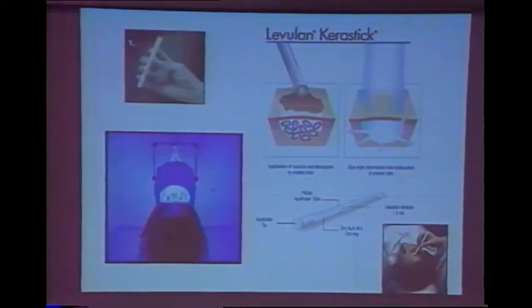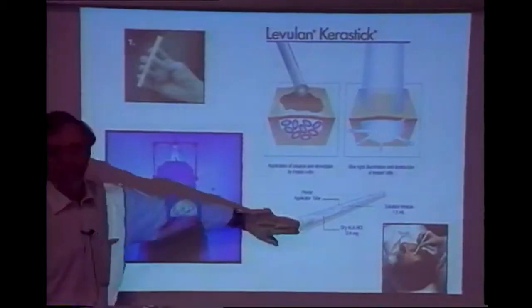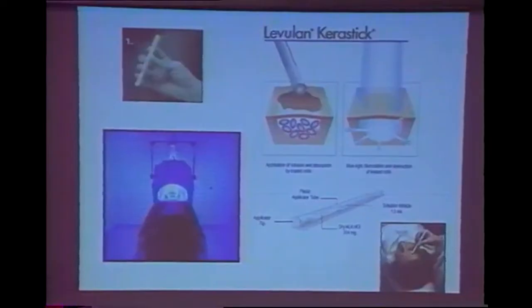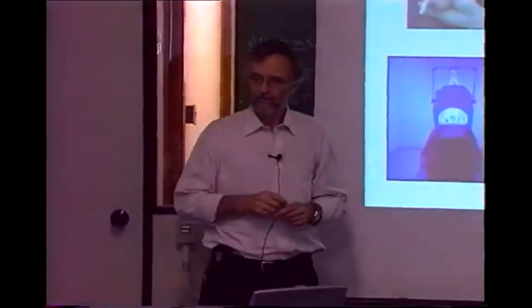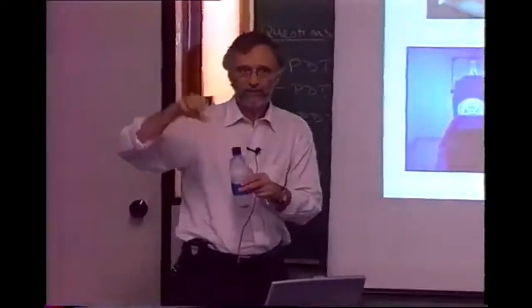Actinic keratosis, just to give you an idea of what this looks like. Here's the blue light source. In this case, a drug, which is ALA, applied topically. This is a good example of medical engineering. So if you're going to give a topical treatment of a drug, and you're going to put the drug on the individual spots, how do you do that? Does the physician buy a bottle and take a piece of cotton wool?